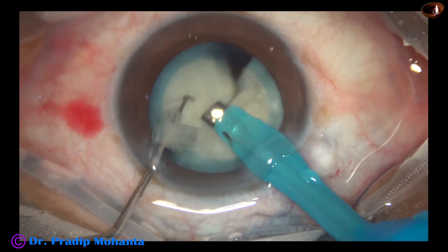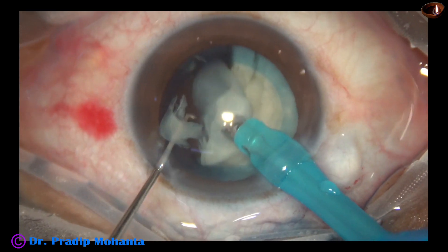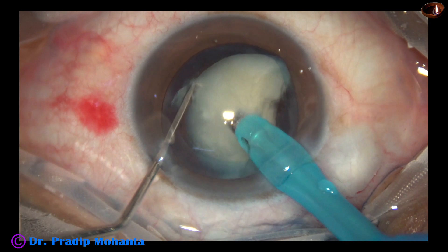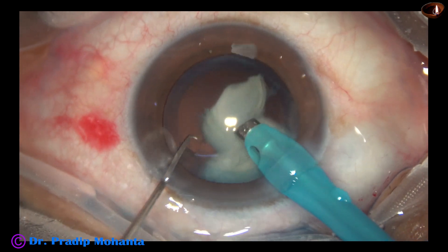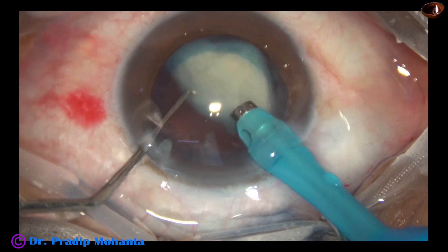The ultrasonic energy is 60%, flow rate is 45 ml per minute, vacuum is 450 millimeters of mercury. This is the other half of the nucleus. It is divided into two pieces, and the larger pieces are subdivided into smaller pieces, and they are easily emulsified.